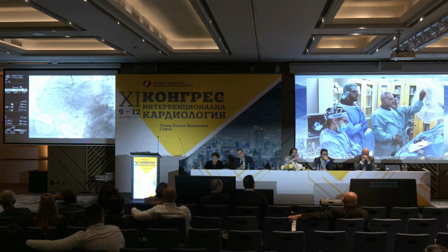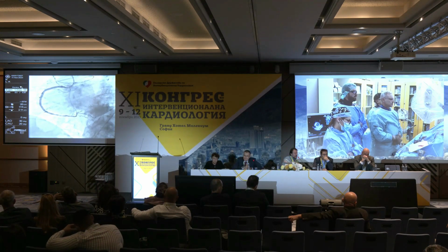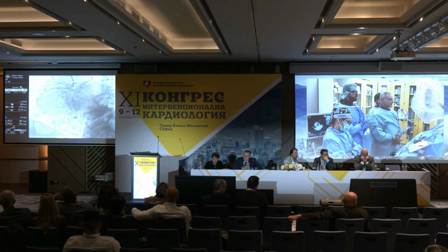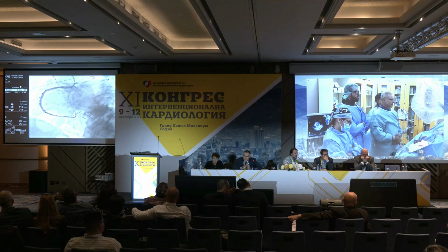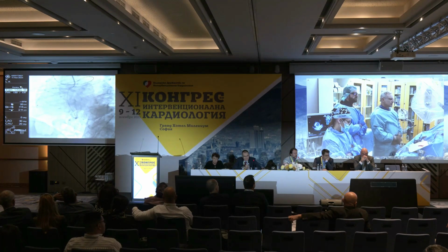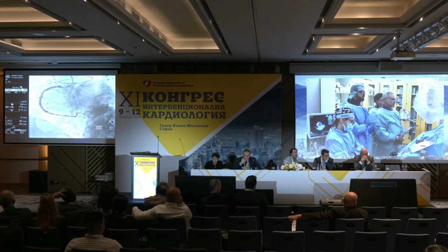It's opening, but it's still in the architecture, I think. And it's not spilling into the pericardium. You have just a crater there. It's obvious that there is no pericardial spilling. Yeah. We're just trying to evaluate what this branch is. I think it's potentially a branch in combination with the subintimal tracking of the Confianza.